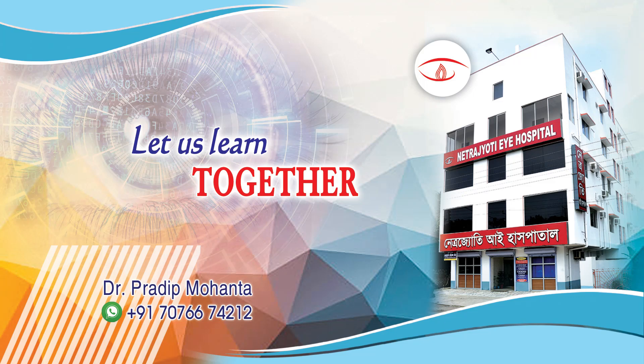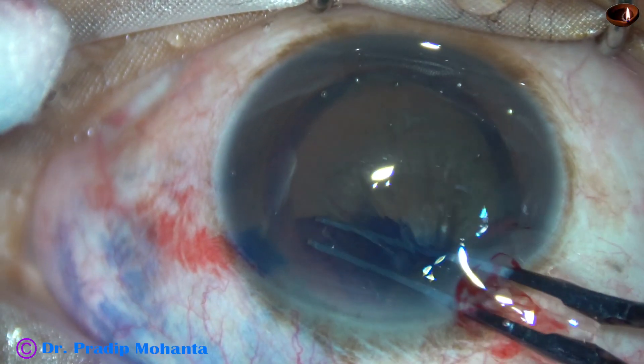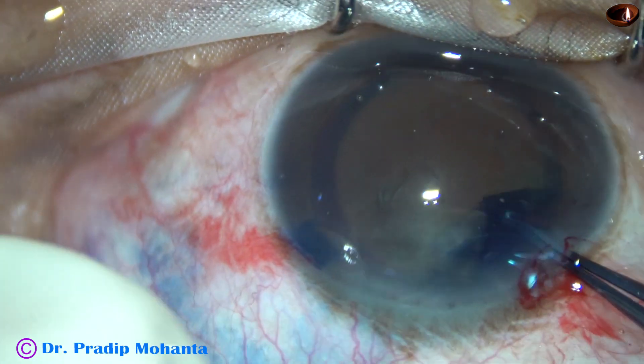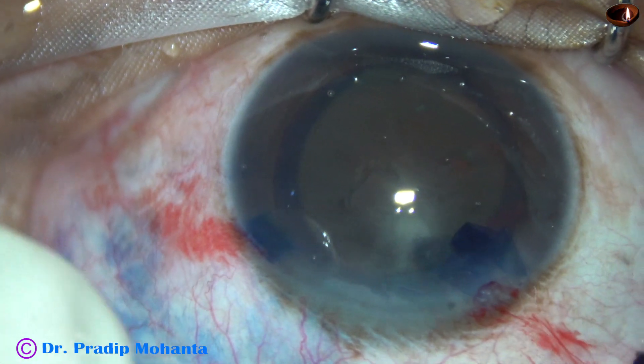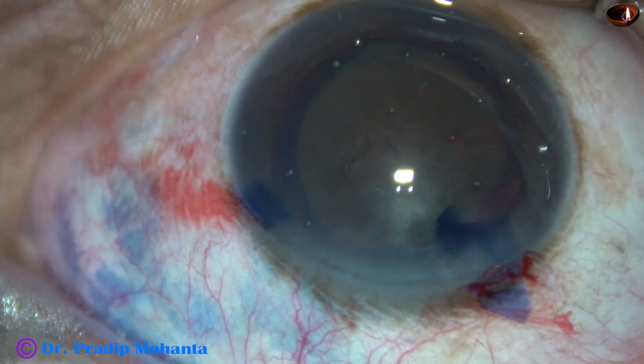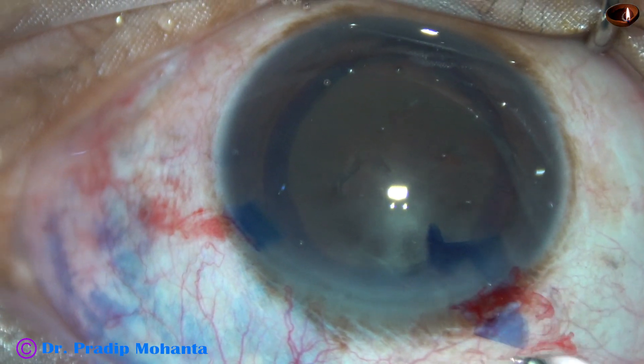Friends, welcome to my workplace at Ranaghat, West Bengal, India. In this video, I am going to show management of two very hard nuclei by my technique, Submarine Chop. This is the first case. You can see the cataract is black — it can be called cataracta nigra.